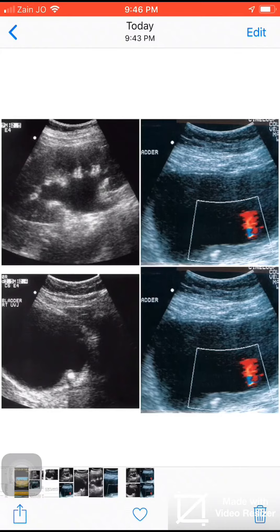As we see here, there are hydronephrotic changes involving the right kidney and the ureter. There is also an echogenic area noted on the retrovesical region on the right side with shadowing, consistent with a stone.